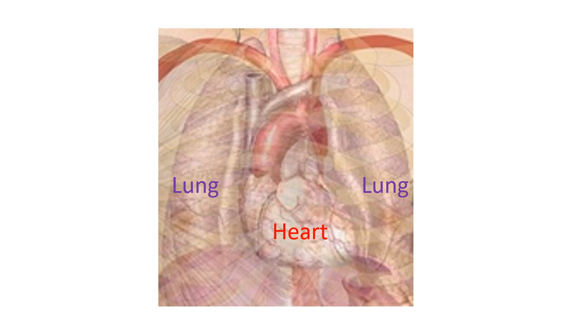Lungs may overlap the heart intermittently while imaging the heart from the chest wall. This is because the lungs cover part of the heart during inspiration and interfere with the image quality. In those with hyperinflated lungs, as in emphysema, this causes a poor echo window.